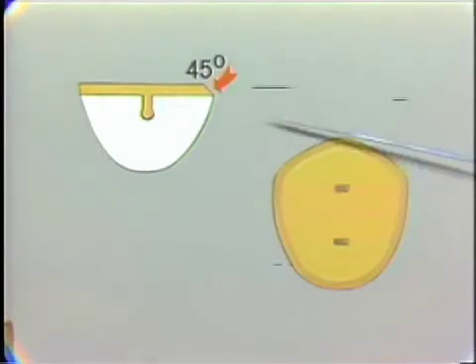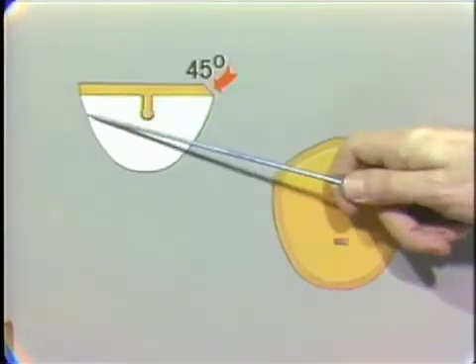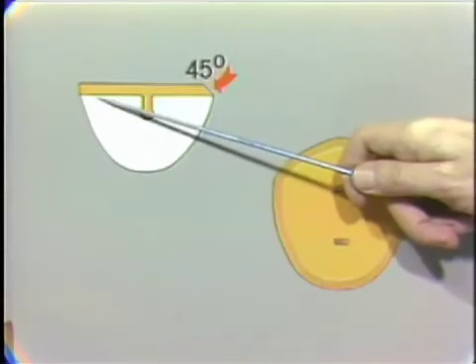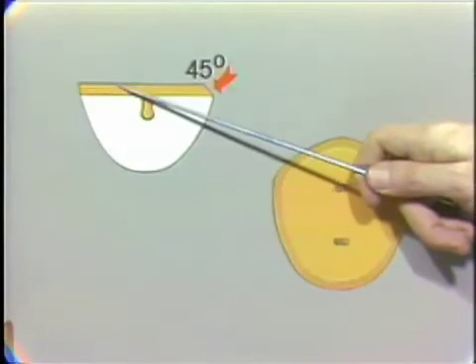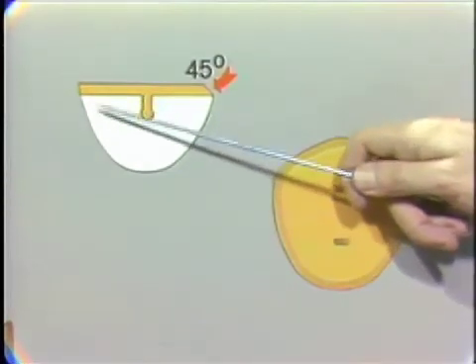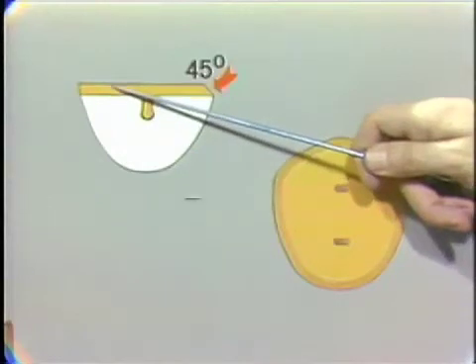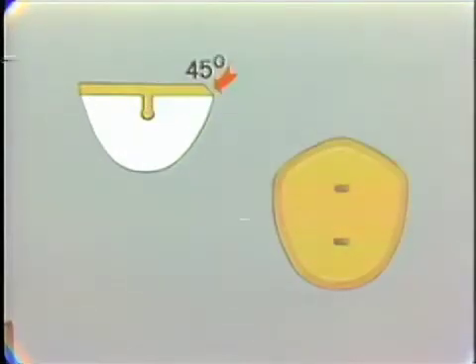In this particular situation, you'll remember that we had put a bevel here on the porcelain itself, and our backing is sort of set back in this position. We bevel this to follow on and match from the bevel on the porcelain, so that in the finished pontic, in our case, we'll have this gold extending down into that region, being covered by the wax and the cast gold.